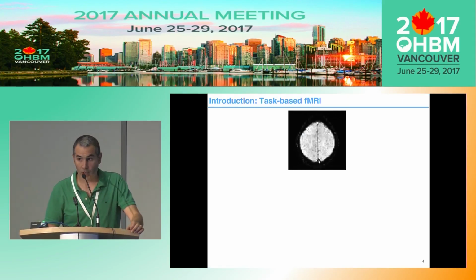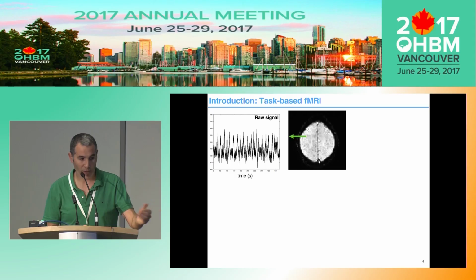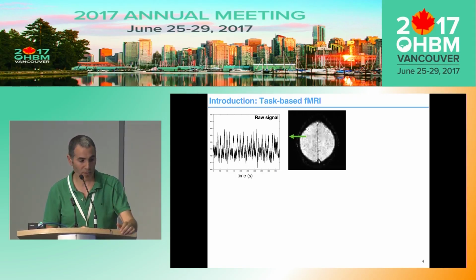So let's start with the basics of fMRI data analysis. As you know, in fMRI, we collect T2-star weighted images while we are doing an experimental paradigm. What we have is a series of time points that measure differences in the concentration of oxygen in blood in response to the task.